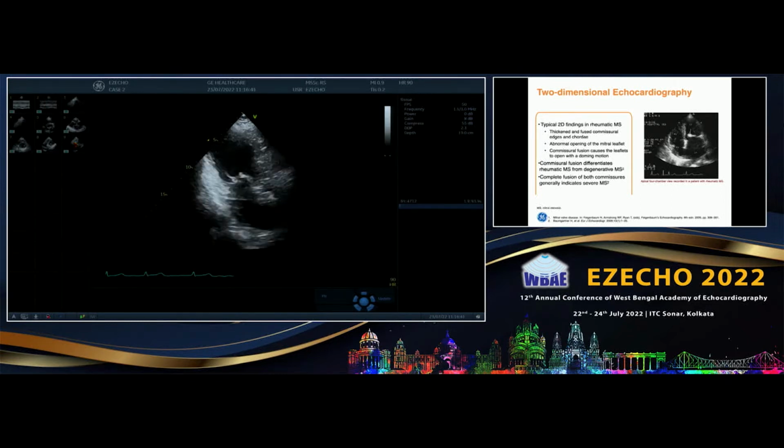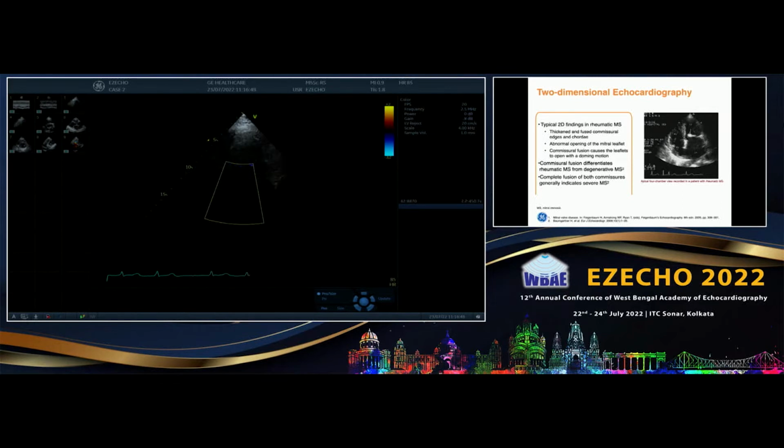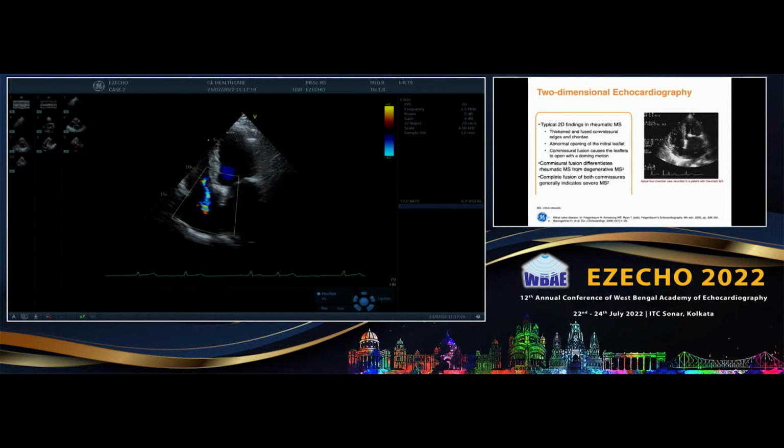Then let us look at the color Doppler qualitatively for the aortic valve. Not much of stenosis. Yeah, there is probably a little, adjust the gain. Look at a short axis also. Correct. So in that case, now see how you build up the case. If both the regurgitant lesions were not that great, why is the LV dilated? And the answer is here. It's probably a chronic AFib which has remodeled the LV. Correct. So now you have an explanation for that.